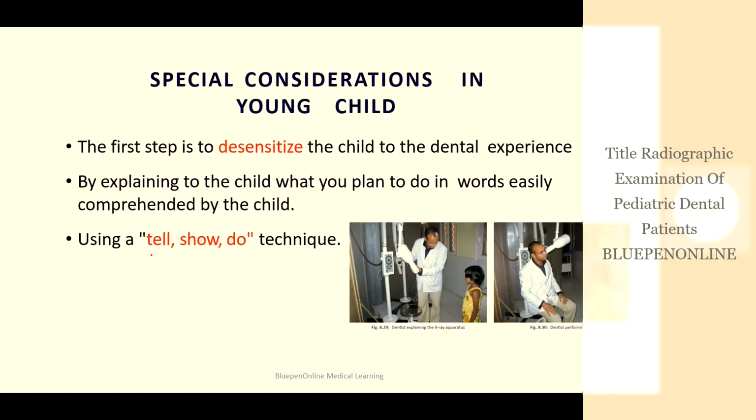Now, what are the considerations to be taken in case of a young child? The first step is to desensitize the child to the dental experience. Explain to the child what you plan to do in words easily comprehended by the child using the tell, show, do technique.